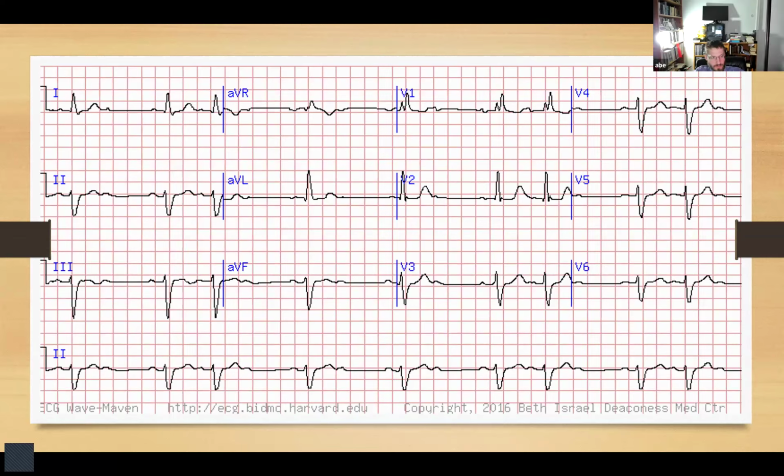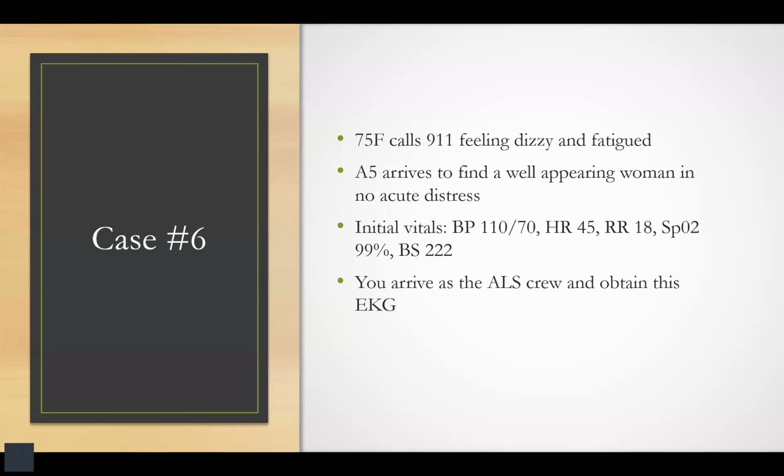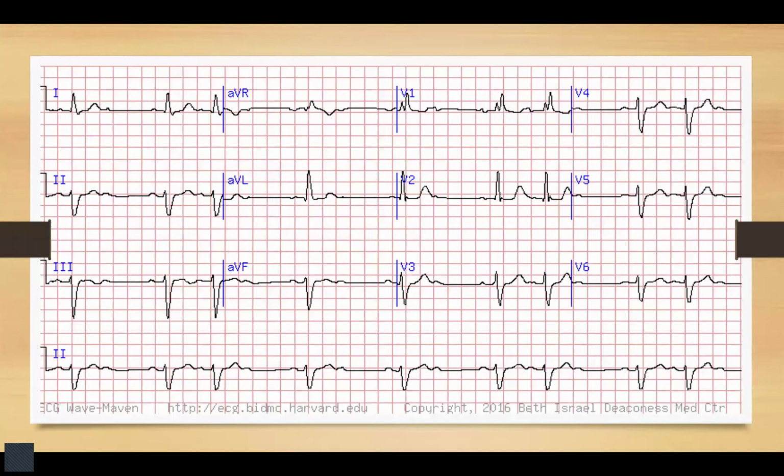Depends on how she's presenting. Okay. Well, she's presenting dizzy. What's the heart rate? Well, you tell me. Do you know how long the strip is? Right, so let's say it's kind of standard length. Probably, if, gonna start off with some fluids.